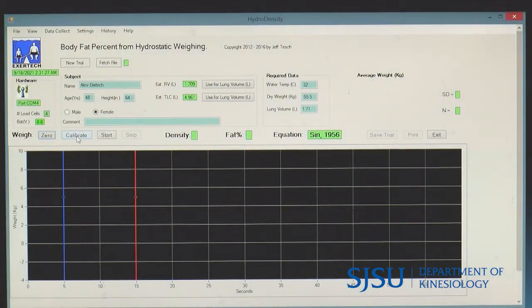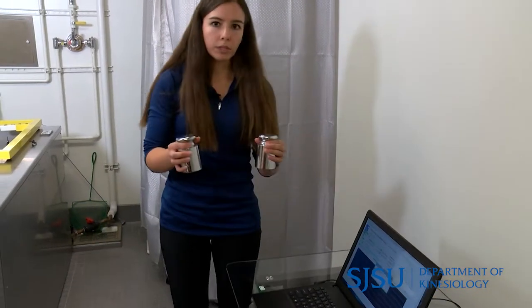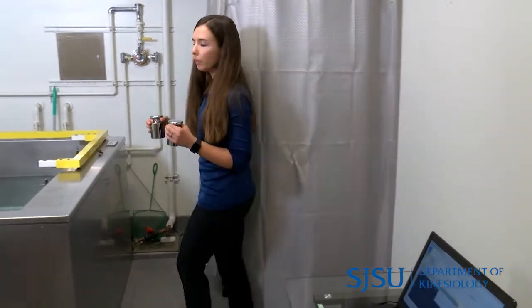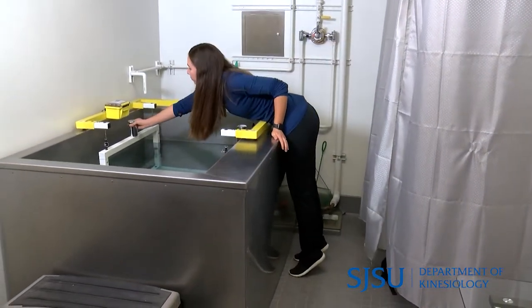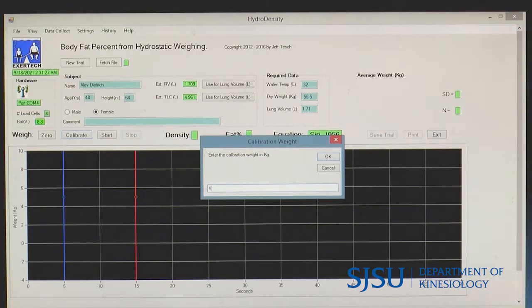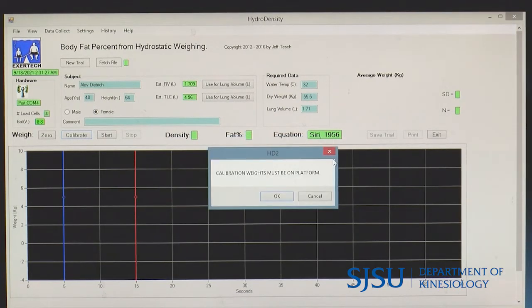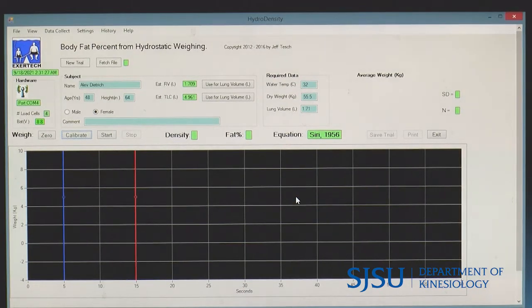Now I'm going to hit calibrate. I'll take my two calibration weights — they weigh two kilograms each — and place one on each of the white bars. I'll enter four kilograms in the software and press OK. The calibration weights are on the platform, and the calibration has been completed. I'll go ahead and remove those weights.